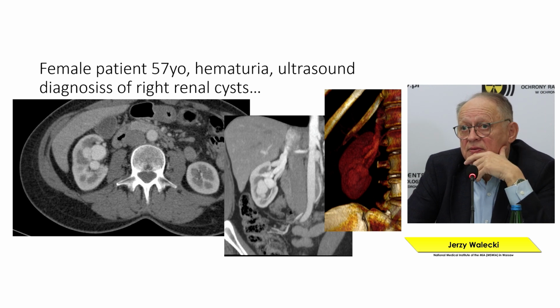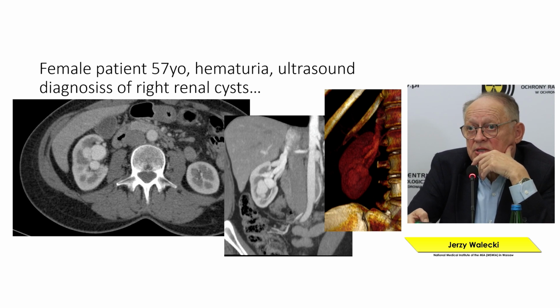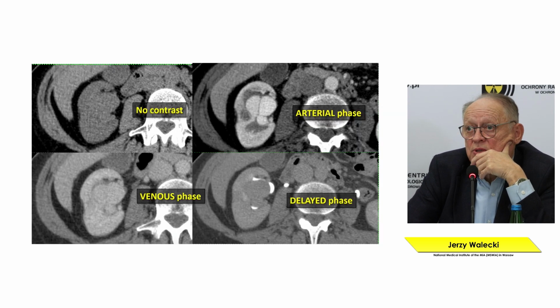A very interesting case and an important one. You can see the application of our techniques in a very different, very specific cyst in the right kidney. So a vessel was reconstructed, a CT exam was used. So we have noted big reservoirs filled with blood. So we knew that they were vascular changes. We had to use occlusion, and these are some CT scans. So you can see the filling of these major changes, and this is the late phase when the blood is outflowing.